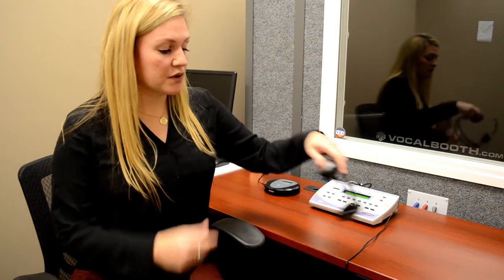Every time you go to use your speech at the beginning of the day, you should always check to make sure that your VU meter is set correctly. So I'm going to show you how to set your VU meter correctly for the mic. If you're using your own voice to do the speech, I'll teach you how to do that first.